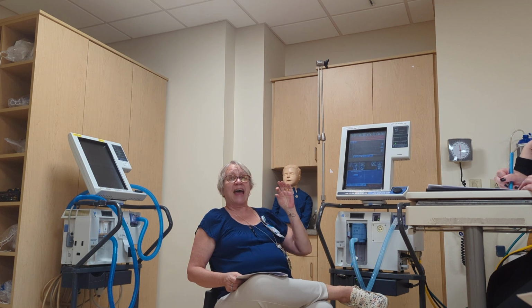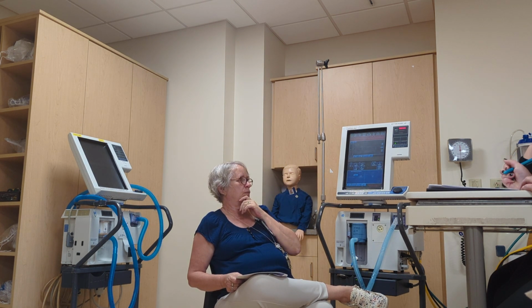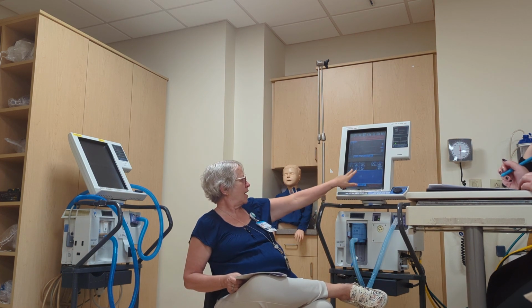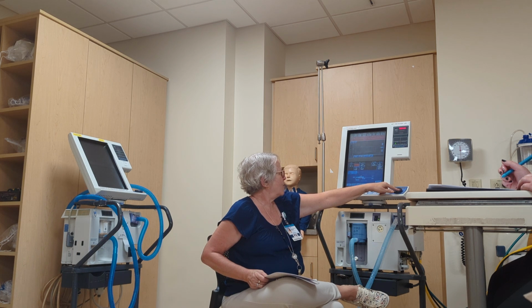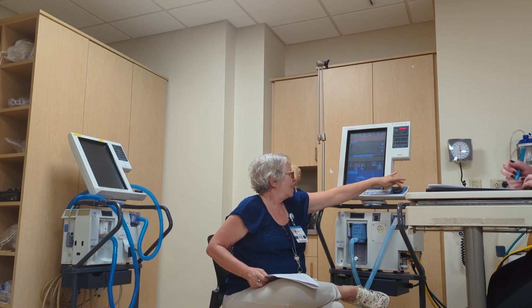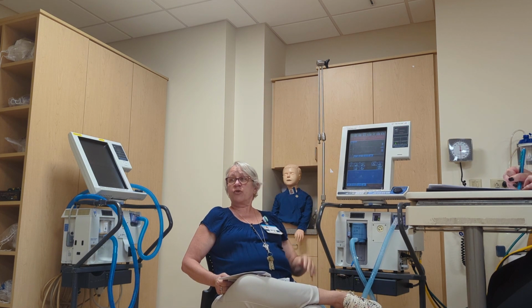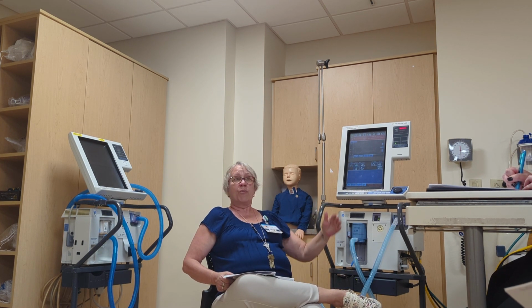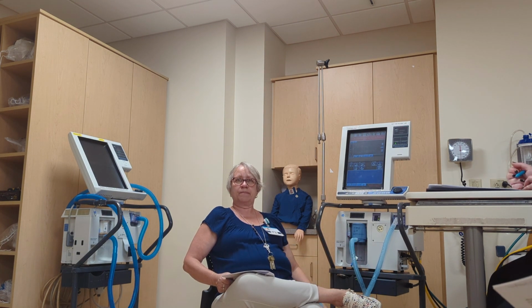That's how I correct my tidal volume. Do you hear the difference between those? It gets confusing, so now I gotta turn this up to 580. Now I am delivering 500 milliliters to my patient because I'm losing just about 80 milliliters to my tube.